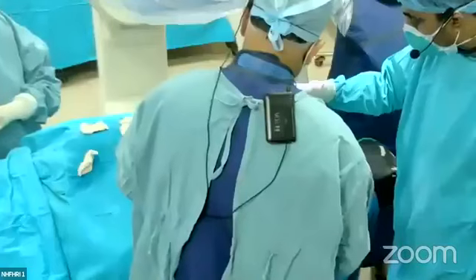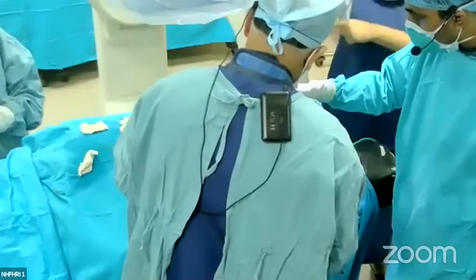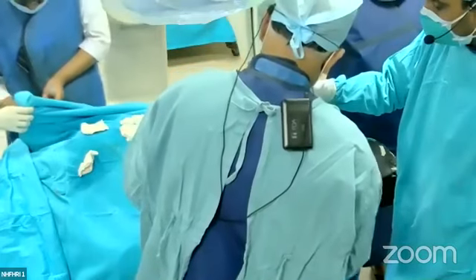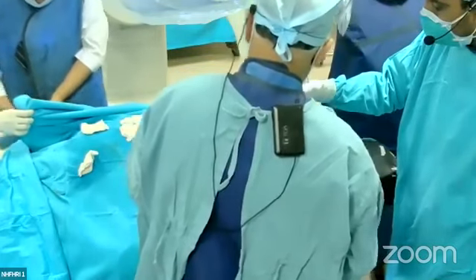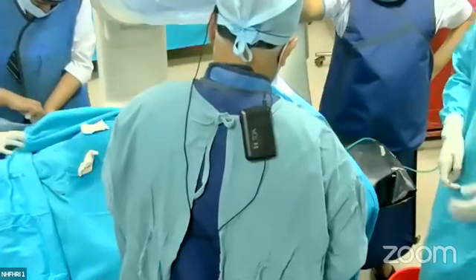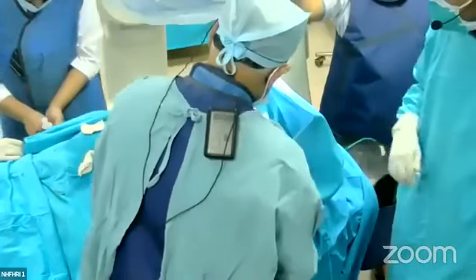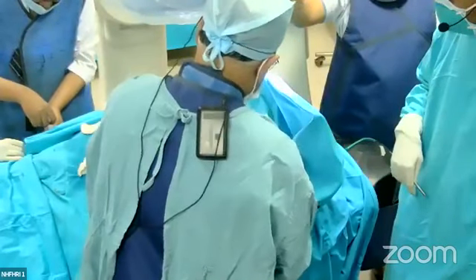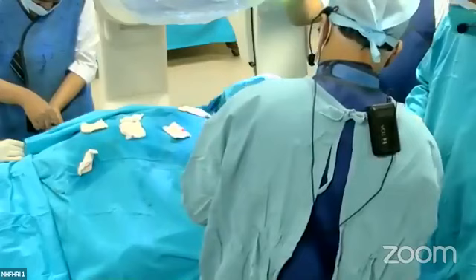Is there any role of post-implantation X-ray? Sometimes, if the patient is on rate-limiting drugs like beta blocker, calcium channel blocker or digoxin, the patient may come with bradycardia, bradyarrhythmia, complete heart block and syncope. So this may be asked, how long you will wait to see whether the patient comes back to normal rhythm after stopping drugs.